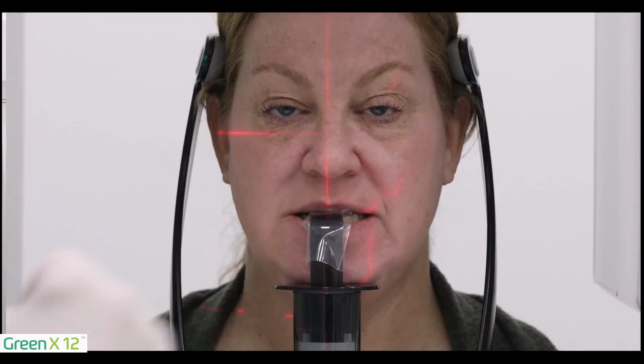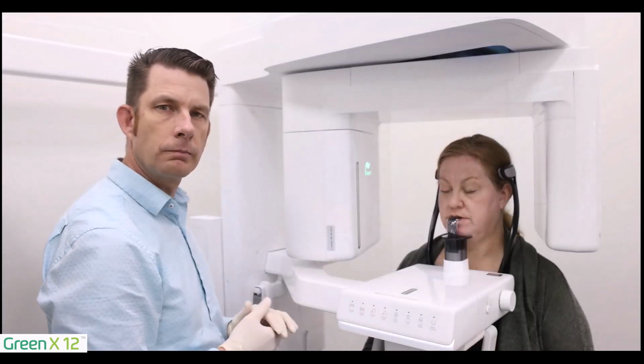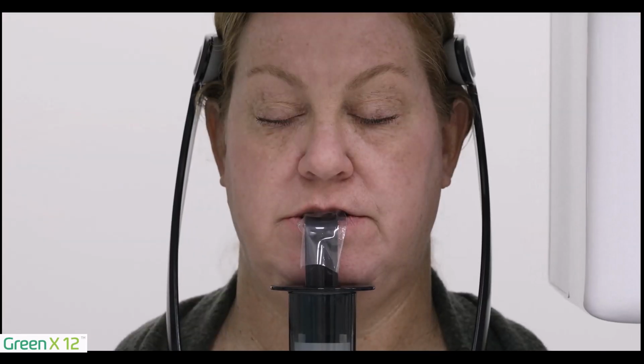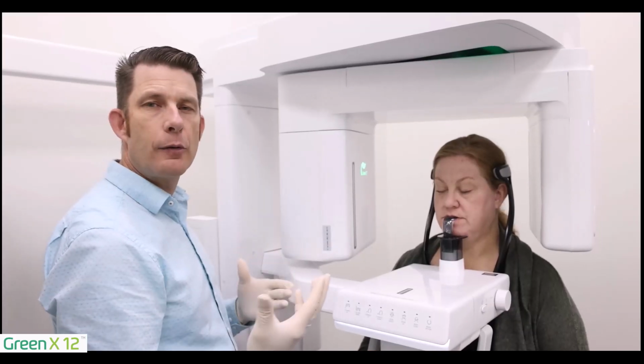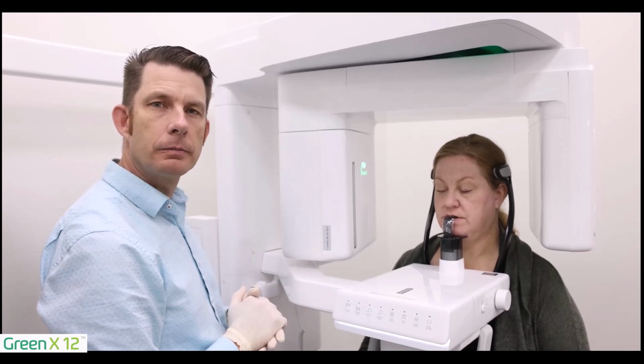All right, go ahead and relax. The system is ready to capture an image. Please close your eyes until image capturing is complete. We'll now step out of the room and capture our image.